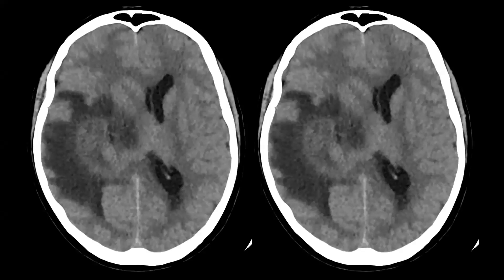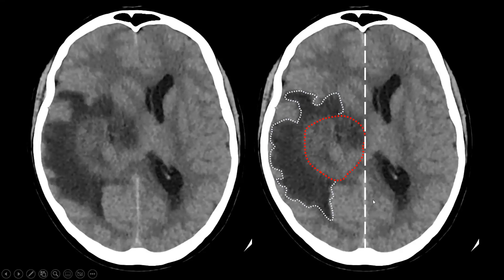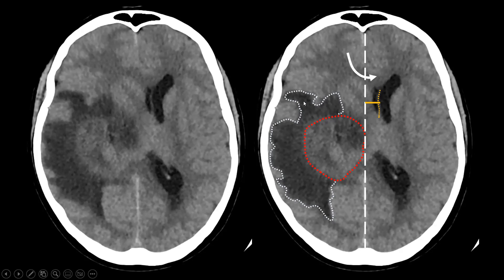Here is an example: a patient who presented at the ER with headache, decreased level of consciousness, and neurological deficits. On non-enhanced CT we see an isodense brain tumour in the right thalamus surrounded by oedema. Drawing a line along the falx cerebri, the septum pellucidum, normally at the midline, has deviated to the left — a midline shift with sub-falcine herniation. Always report your midline shift and the presence of sub-falcine herniation.